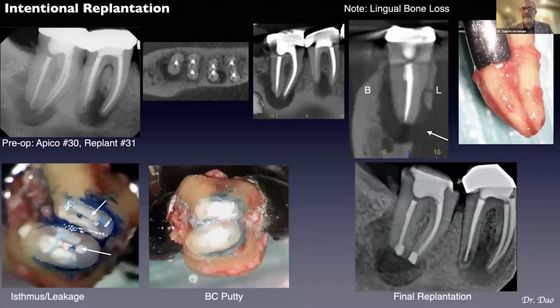This is my last case before I say goodnight and answer questions. I put Dr. Dow here because this is my first year resident, and we just did this case 2 days ago on Tuesday, and I wanted to add it to you. All of us in dental school learn how to extract teeth. So if you can extract the tooth carefully, and I have special forceps, and I talk about everything here, the purpose of the cone beam, why I want to show this, is that the cone beam showed that there's erosion of the lingual plate of bone and a big lesion here. So I use this to direct how I'm going to extract the tooth.